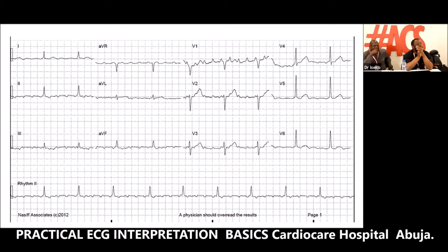Great. So why did she say atrial flutter? There are multiple P waves before the QRS. Yes. So there is a P wave, no QRS, P wave, no QRS, P wave, no QRS. You see, after a while, you don't have to remember those five questions. If you keep on reporting, once you just see it, you recognize it. But those five questions are needed. When the ECG gets very complex, even me, I go back to those five questions and ask myself step by step.